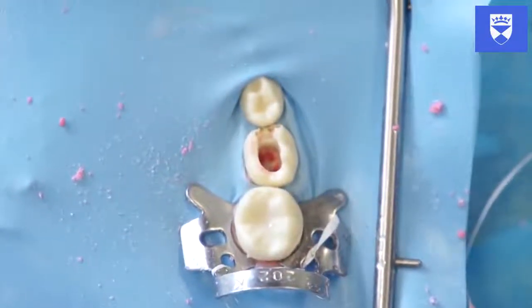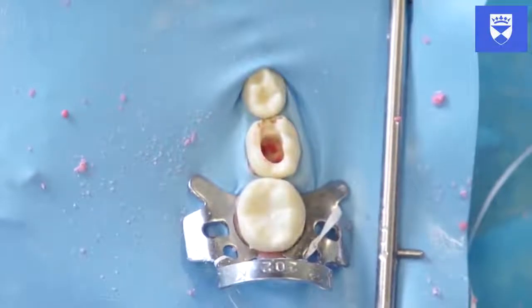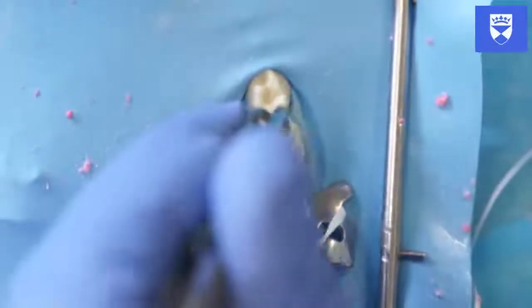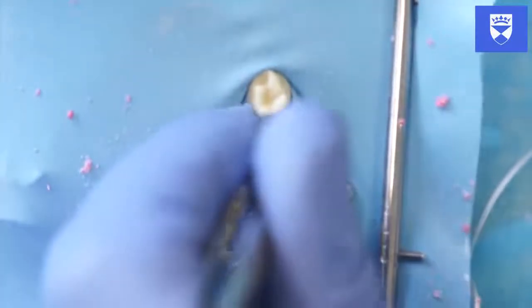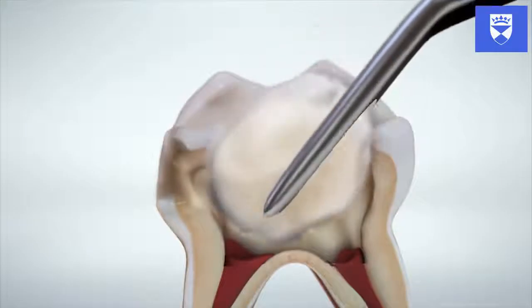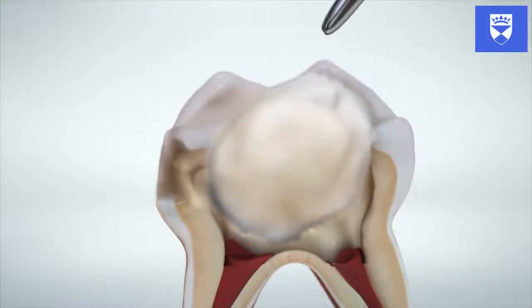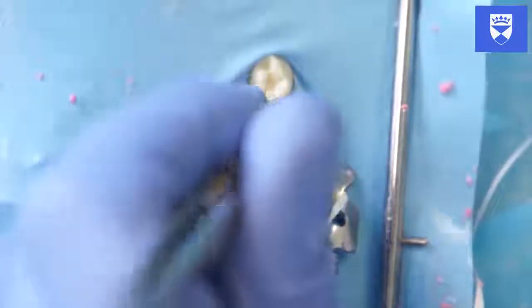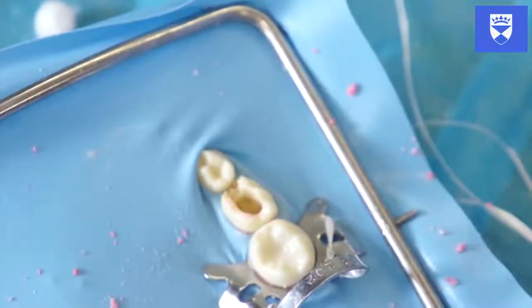When you are happy that the inflamed pulp has been removed, it is time to achieve hemostasis. For this, place a cotton pellet soaked in ferric sulfate onto the remaining pulpal tissue and canal entrances. Use tweezers to deliver the cotton pellet into the access cavity, pressing firmly. Leave the ferric sulfate in contact with the pulpal tissue for 1 to 2 minutes.